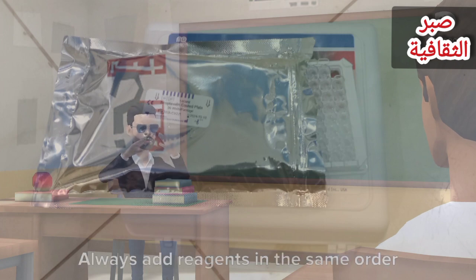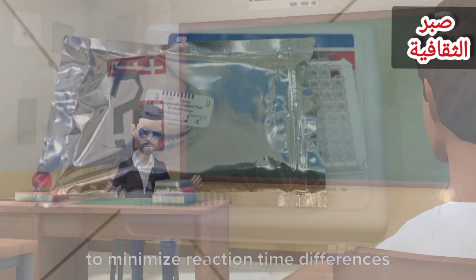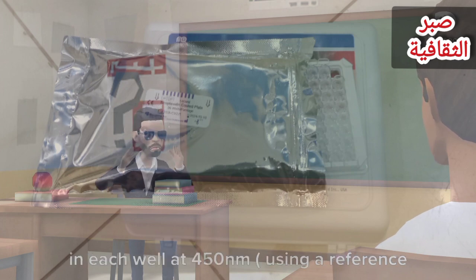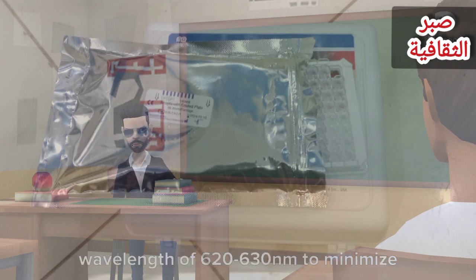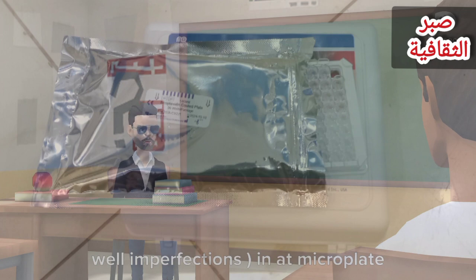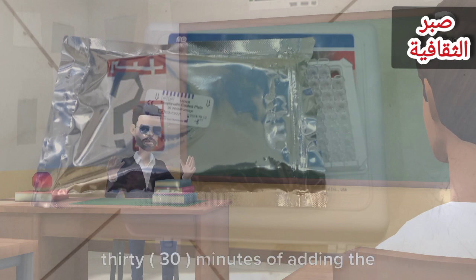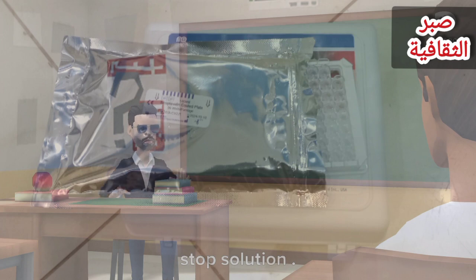Add 0.050 milliliters, 50 microliters of stop solution to each well and gently mix for 15-20 seconds. Always add reagents in the same order to minimize reaction time differences between wells. 10. Read the absorbance in each well at 450 nm using a reference wavelength of 620-630 nm to minimize well imperfections in a microplate reader. The results should be read within 30 minutes of adding the stop solution.